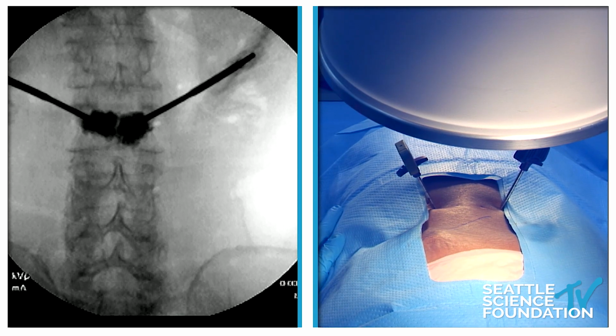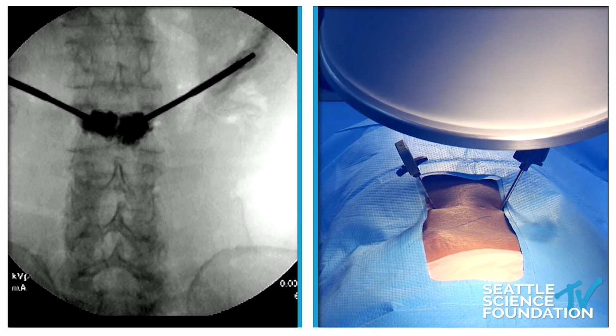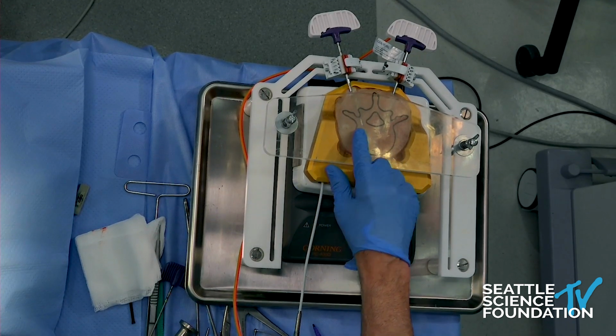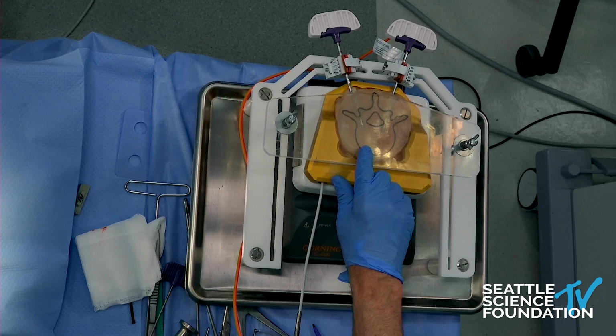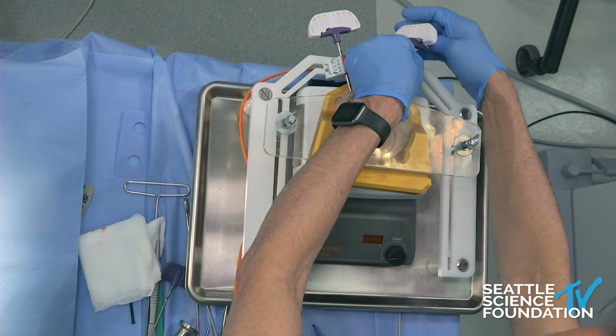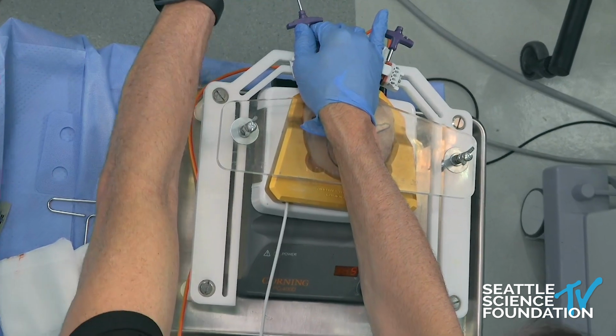And speaking of neoplastic fractures, we're going to show you the OsteoCool device. This is a chicken breast on our tabletop, and we have a vertebral body drawn on it. After the access to the vertebral body, we are going to plug in the water-cooled probes and do RF ablation of the anterior portion of this. The chicken breast is just designed to change colors so you can see the ablation zone.